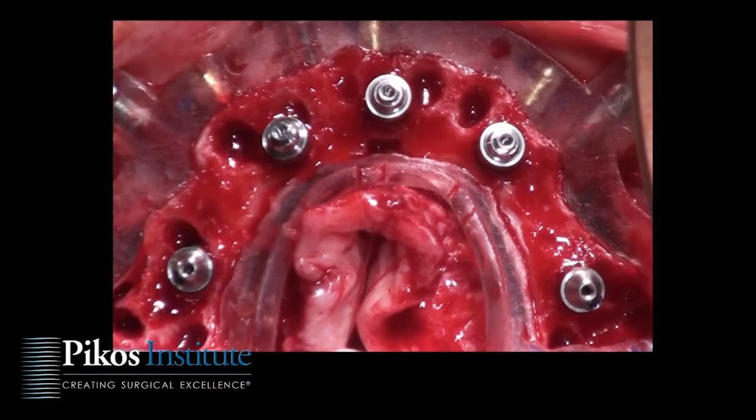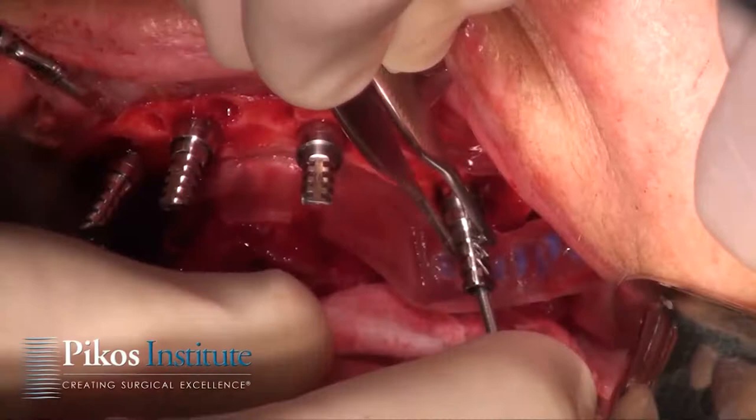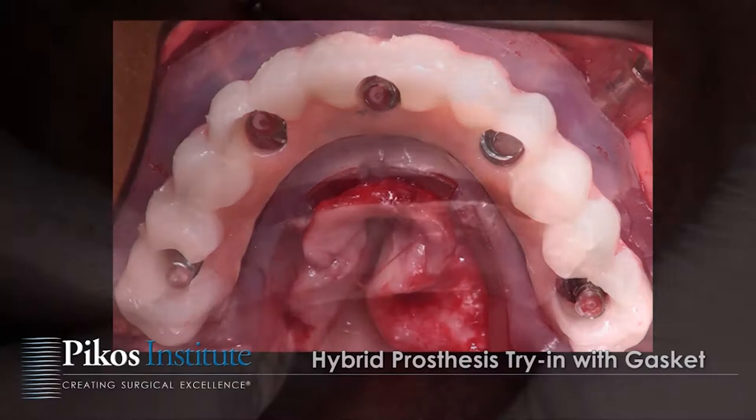We also have a segment of live surgery — typically a maxillary arch — which is what I'll share in this video clip. We close out with a segment on complications and some marketing elements as well. We truly encourage the team approach for this protocol, so we encourage surgical specialists to come with your top two or three restorative individuals to learn it together.